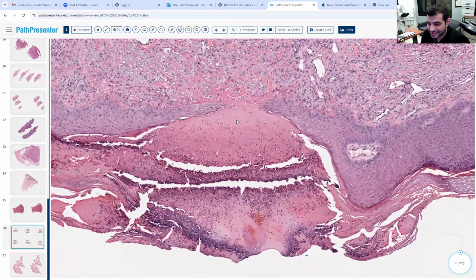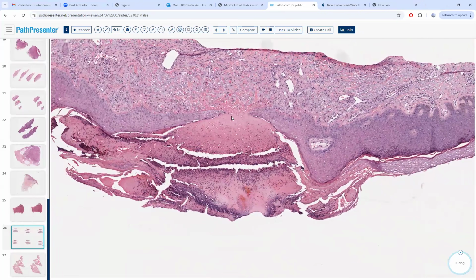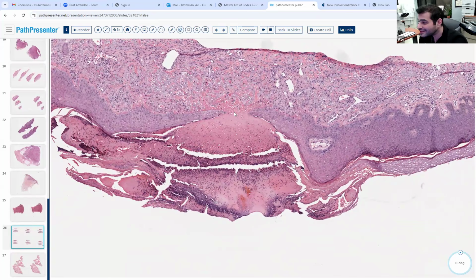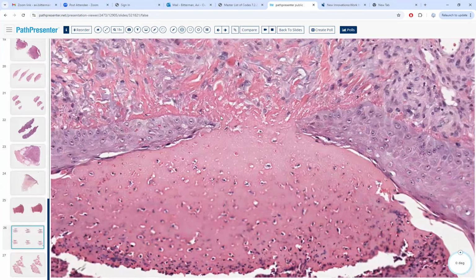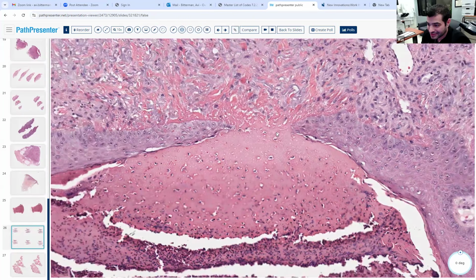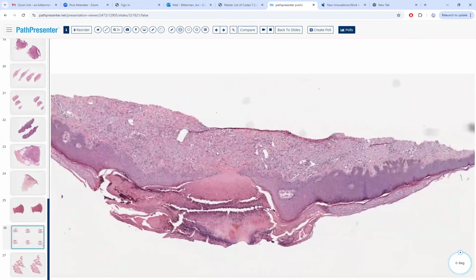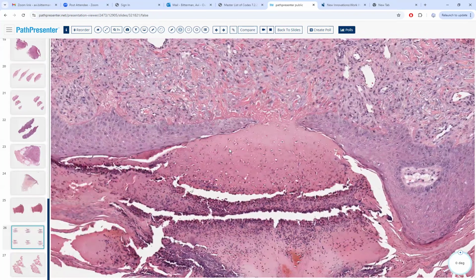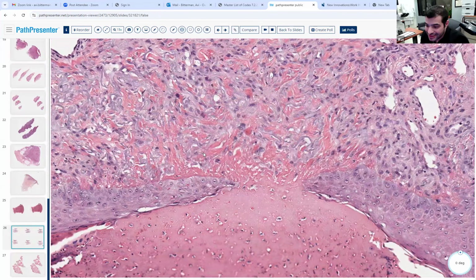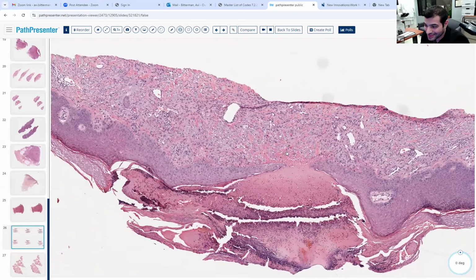What's going on here? It's spitting out whatever it was. There are fibers here. Something's coming out of here. The epidermis is missing right there, and it's serous, crusty, and neutrophilic, like it's eroded. Yeah, so that's true. Or is it perforating? I don't know. That's the other thing. You have to think about perforating.